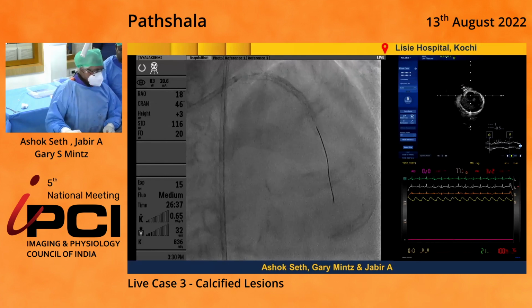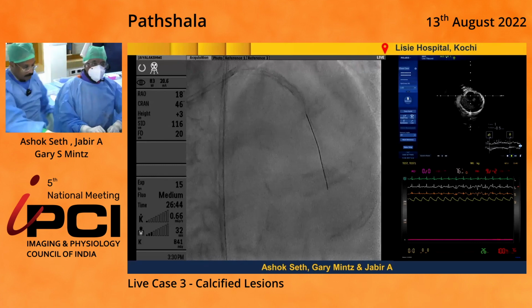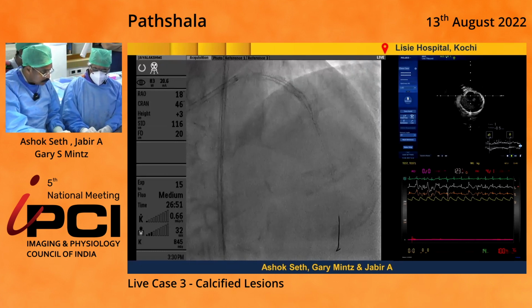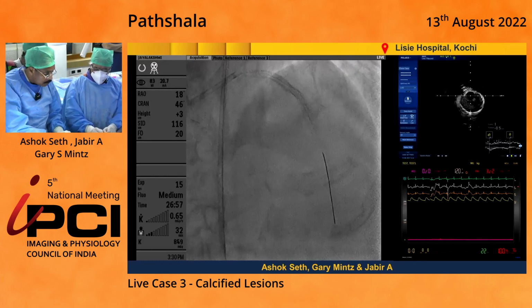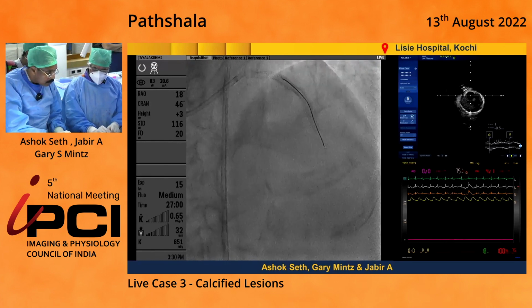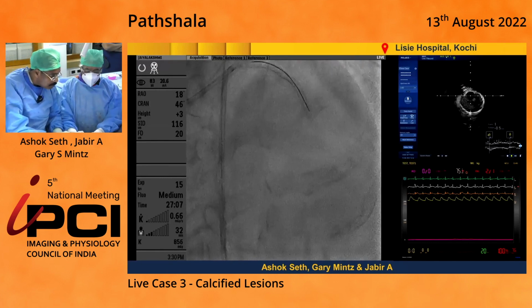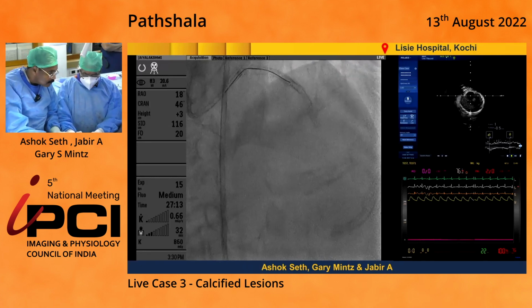So just hold the guiding. Is it good? Hold the guiding. Yeah, it's so tough. The balloon, as it ruptured, of course, becomes a very large profile, and it also, in a way, sticks to the wire. So just getting that out. The other thing is with the balloon, when you go up to 40, it really clamps down on the wire. You have a Grand Slam there, but if you have Xian Blue, then one of these strategies is always to just have a second wire ready, because frequently it'll just seize on the wire as you pull it.